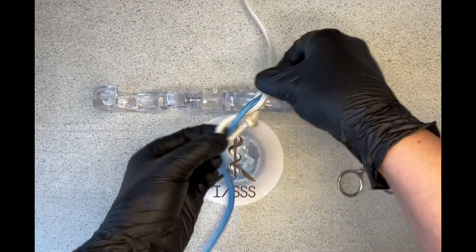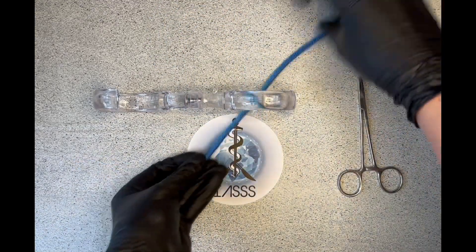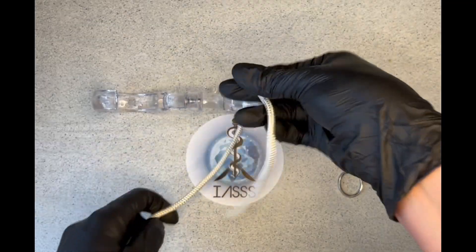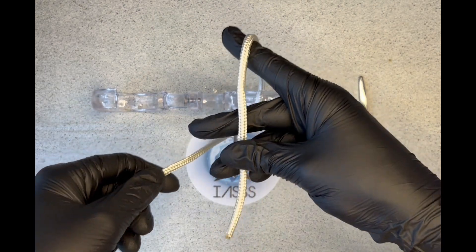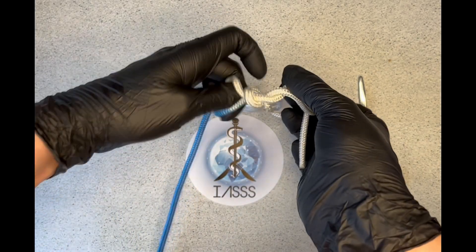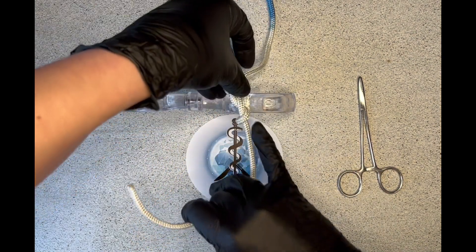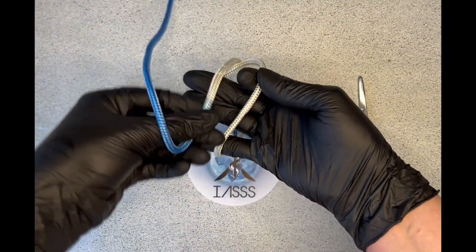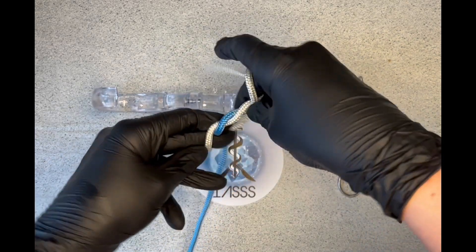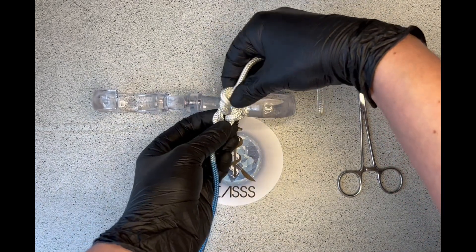Let me show that one more time. Put your needle through, suture towards yourself, bring the tail up towards you. Suturing material between your middle finger and thumb, index finger extended to create your four. Come through with one hand, then through with the other hand and tie it down — there is your double first throw. Again flip the hand over, let it run parallel. Bring the middle finger over and under, loop it through with the left hand as well, and pull it tight into a surgeon's knot.